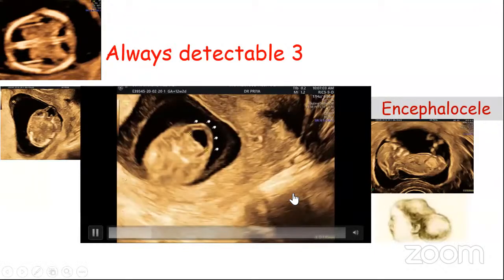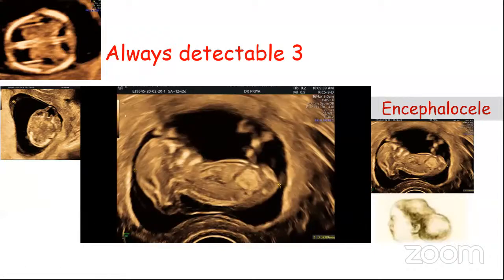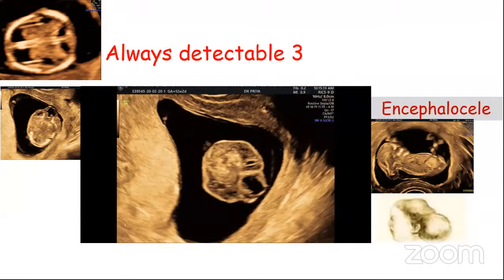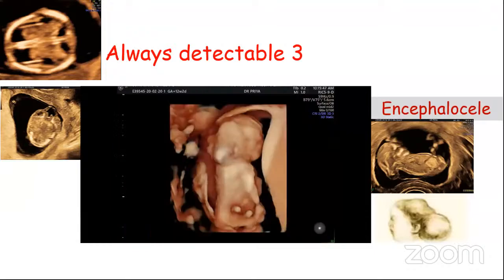Now, when we see this, we should ideally go and look for kidneys, for the polycystic kidneys, and also check the digits for polydactyly, because we know the Meckel-Gruber syndrome and the triad of Meckel-Gruber syndrome, and that's autosomal recessive in inheritance and has a high risk of recurrence.